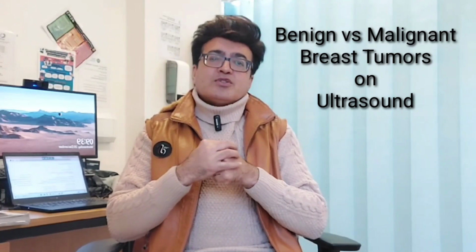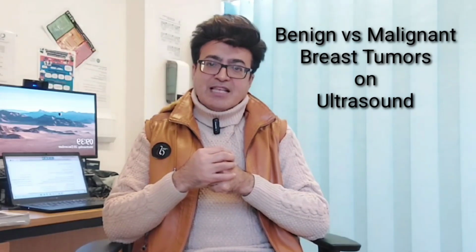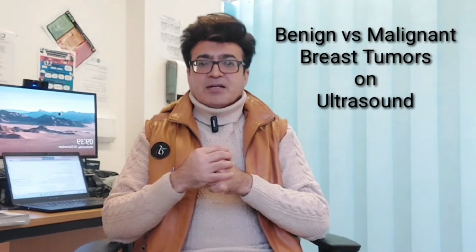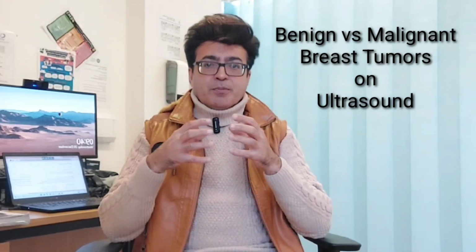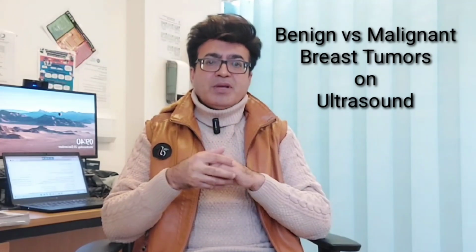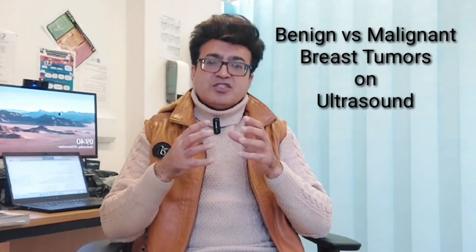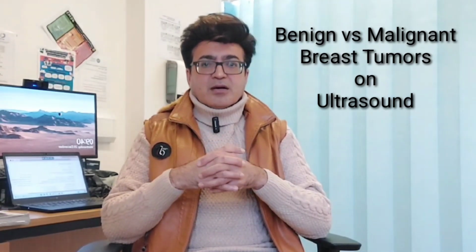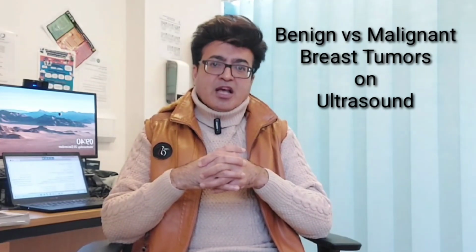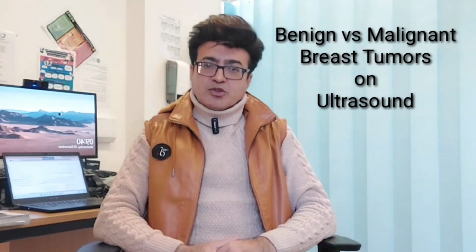Today I'm going to focus on breast imaging, especially when you are scanning the breast under the ultrasound scanner. Which important points do you have to keep in view? This is very important. Many a time in the clinical setting we use this ultrasound equipment for the differentiation of breast masses and breast lesions, but we forget some important points to take into account.